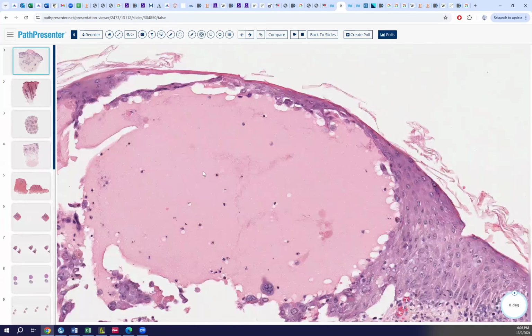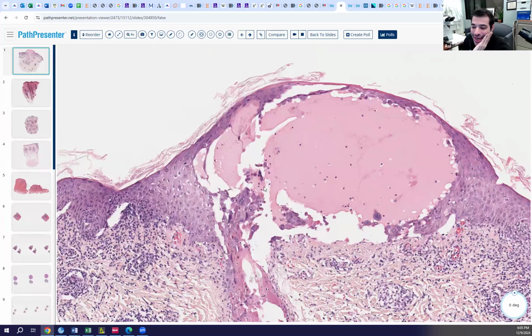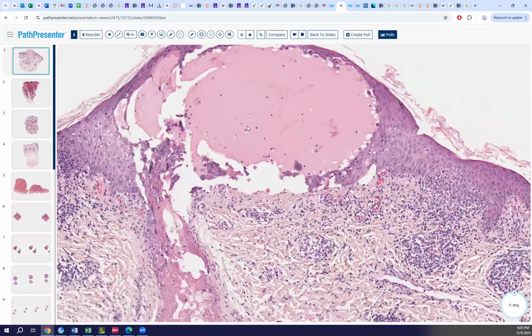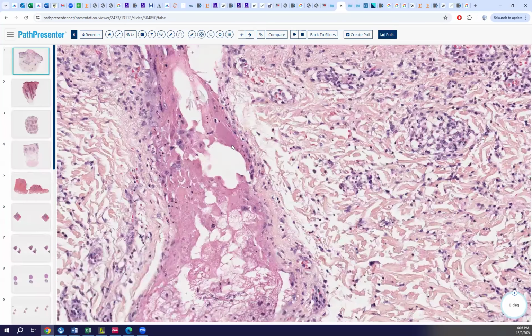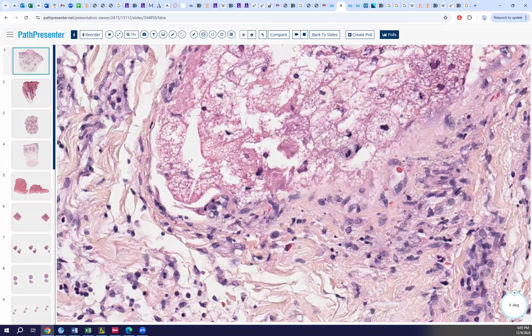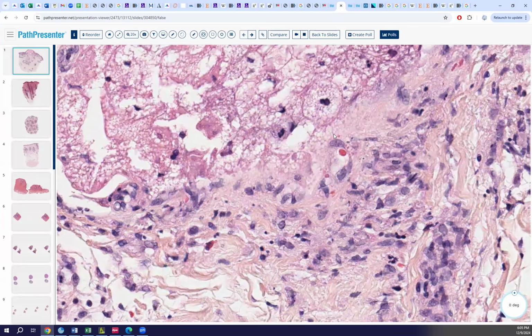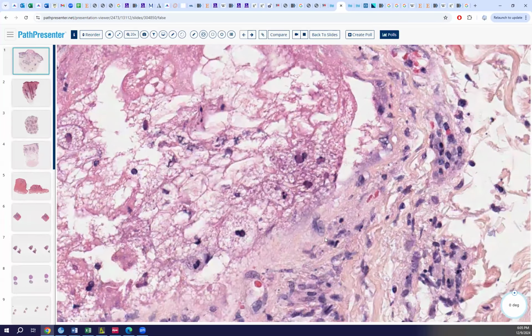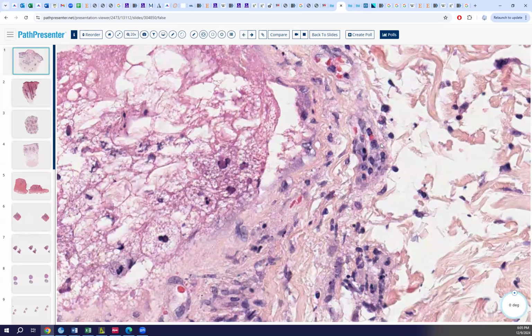Not all pustules are acne. Typically, the neutrophils are going to be down in the hair follicle, and it won't be vesicular. It won't have a big vesicle. Got it. And then these are usually zoster, right? Because zoster virus travels up a different set of nerves compared to simplex when they involve the hair follicle. And this was Nick Galati's diagnosis as a resident. He always got this.